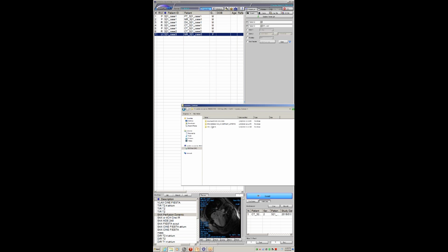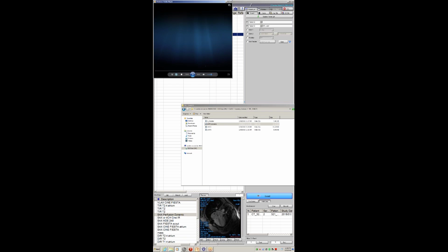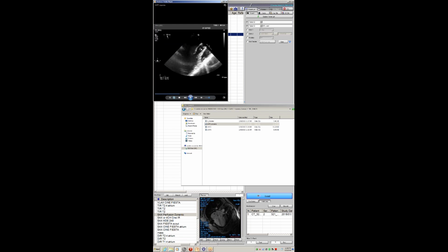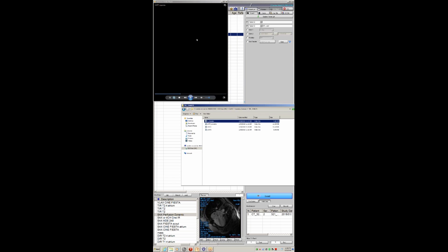Okay, so this is a young patient coming in and had an echocardiogram, which showed, if I can get this to play, that there's no patient information on the echo, but it's going to freeze. Oh, come on, man. Well, that's awesome. You could just describe what we should be seeing. Well, here we go. You would be seeing a mass in the left ventricular outflow tract, and there were multiple other masses as well.